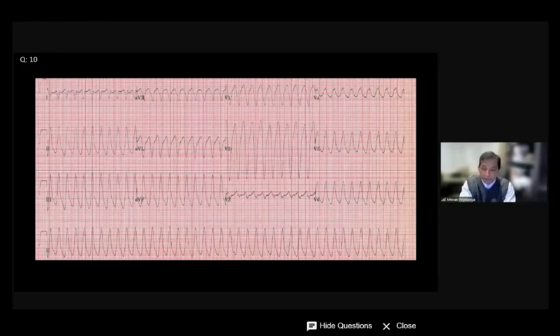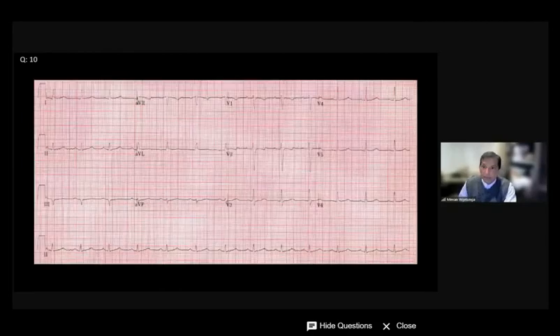So they had to do an electrical cardioversion to establish the sinus rhythm. And so here I have a young man with no heart history prior to that other than this ECG. And then go back and forth, and when he's in sinus rhythm, that's his ECG. And this is a patient of mine I saw some time ago. And this is all I have. I don't have much history, nothing in the family or anything like that.